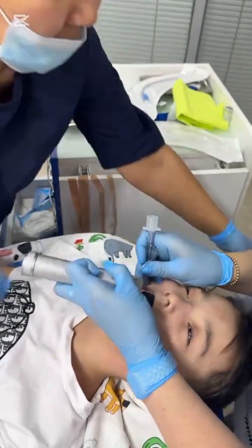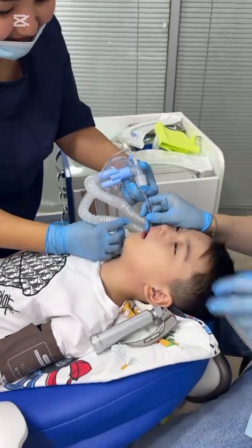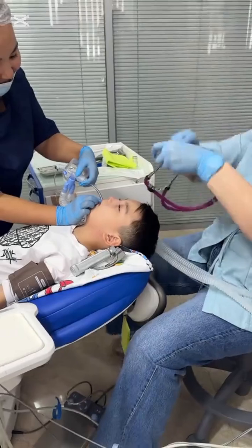Third, if you notice closely, there's a metallic or steel-like structure visible inside the endotracheal tube. Can you identify what it is called and what purpose it serves during the intubation process?